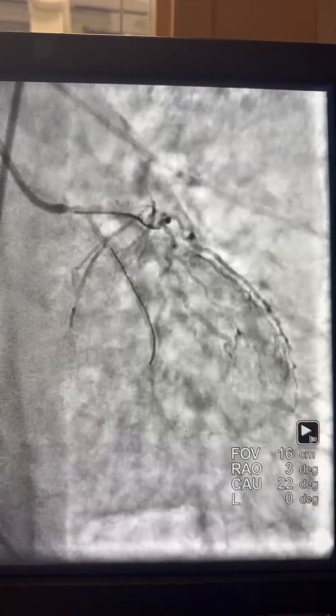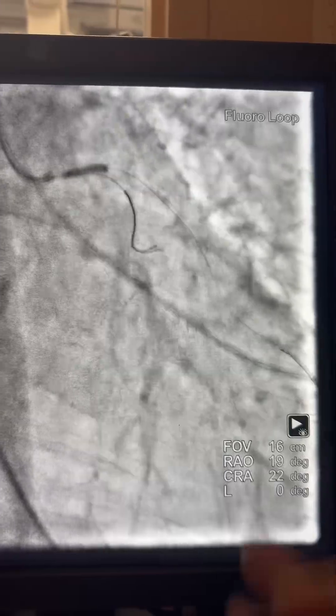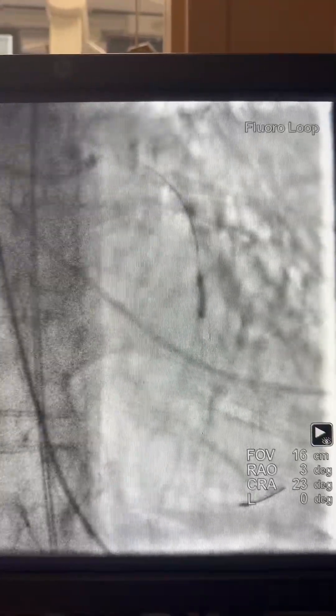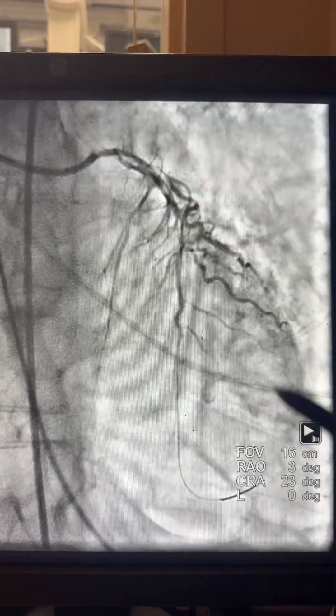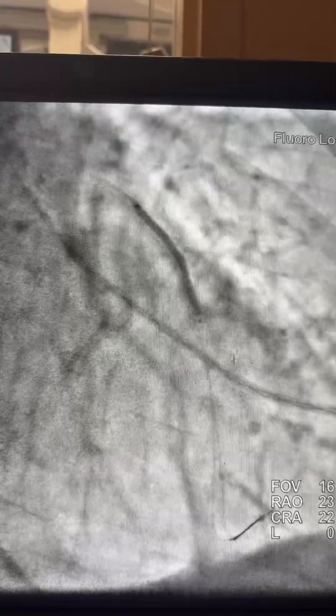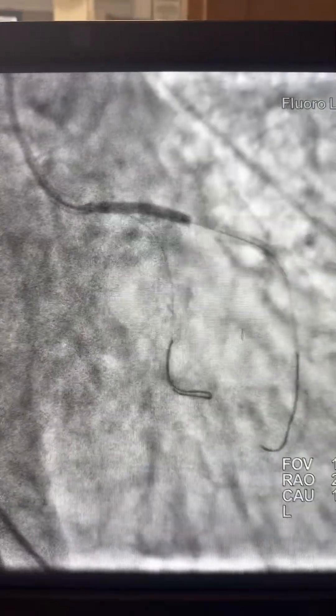I'm directly advancing another wire toward the LCX, and the other wire is advancing distally toward the LAD. Performing inflation again in the left main with a 2.0x12 balloon. Here we have some flow. In a different view, still doing this while doing CPR. Now we have the wire distal in the LAD, which is what we want to establish flow toward the LAD. We have some distal flow and we can tell where we're going to place the stent — starting here with a 2.25x38 stent and then a 2.75 stent toward the left main.